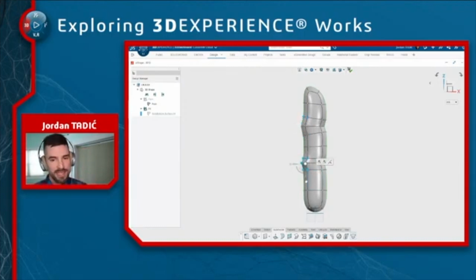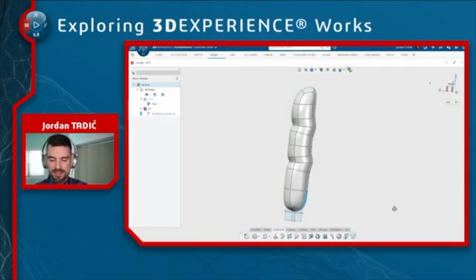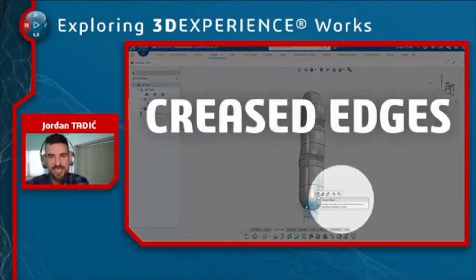And this is just the basic stuff I know that you had already covered with the previous episode, but now we could get into some kind of cooler things. It's starting to look like a finger, but it also kind of looks like a deformed hot dog, a little bit. There's not enough shape in this to make it actually look lifelike, right? So we need to add some more detail.